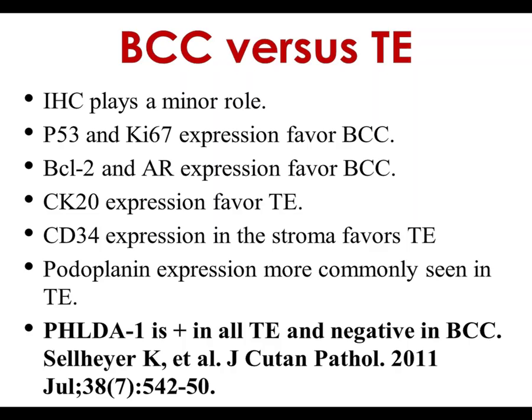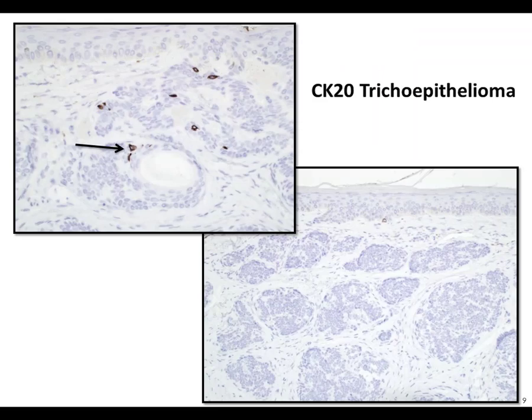Strong expression of CD34 in the stroma strongly favors trichoepithelioma. There is a newer marker called PHLDA1, a follicular stem cell/germ cell marker; a recent study found all trichoepitheliomas were positive and all basal cell carcinomas were negative. However, my question to the authors is: were cases of basal cell carcinoma with follicular differentiation included? I believe they were not, because otherwise those basals would have been positive too. Here we have an example of a trichoepithelioma with preservation of CK20-positive Merkel cells.